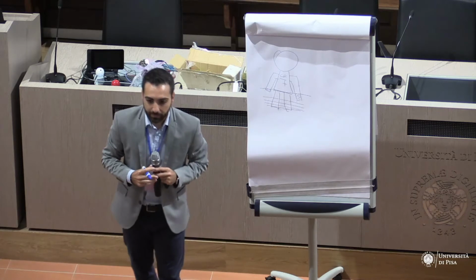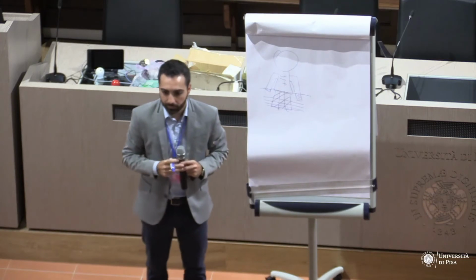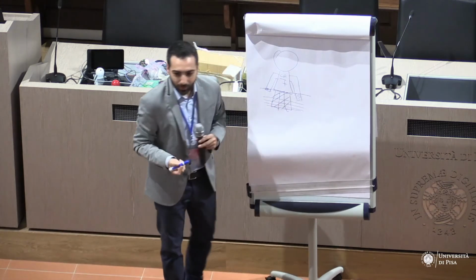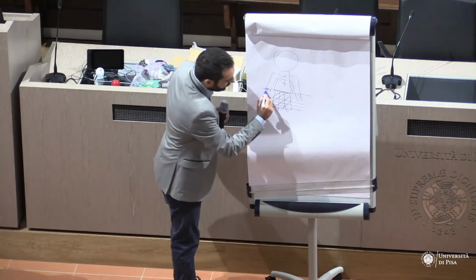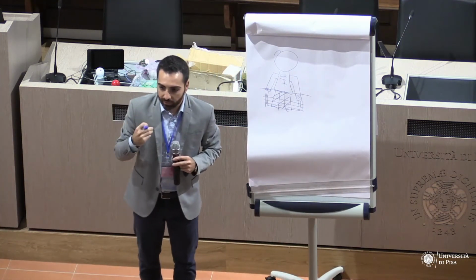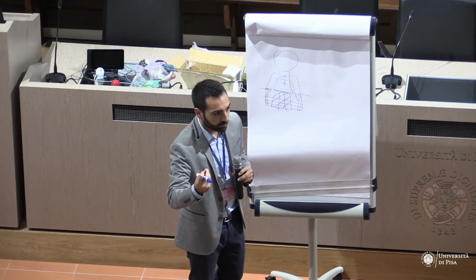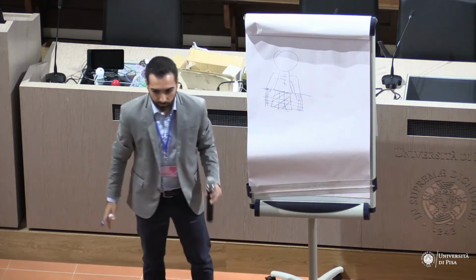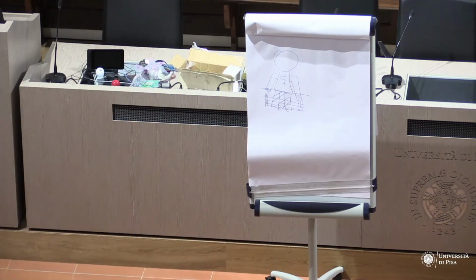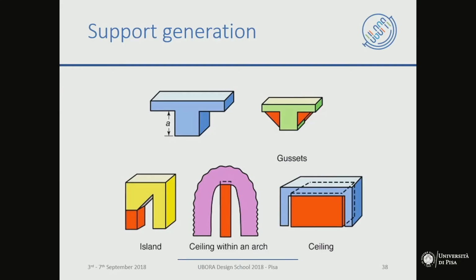These parts are completely separated from the body, which is growing. So this means that they don't know where to stay. So you need to create supports and check that your model is printable before starting the printing process. Otherwise, your fingers will go away. I was thinking about this for like two nights.